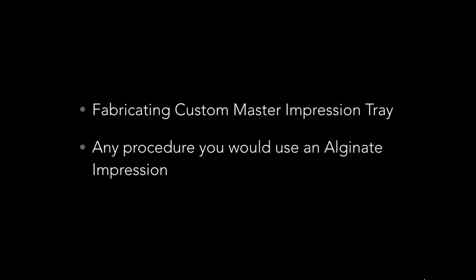They also include fabricating a custom master tray, and partial dentures. The days of partial dentures have declined because of our tremendous success with implants. And it's any procedure where you would use an alginate impression. So these are our functional impressions.